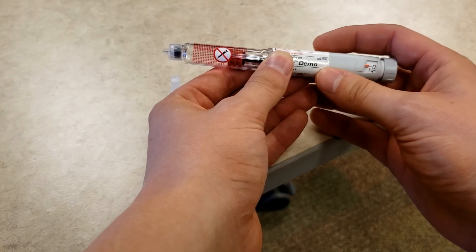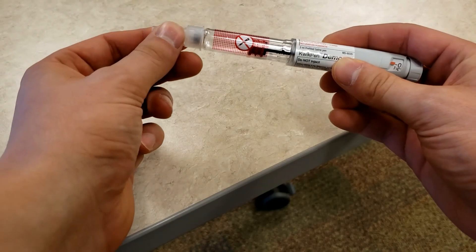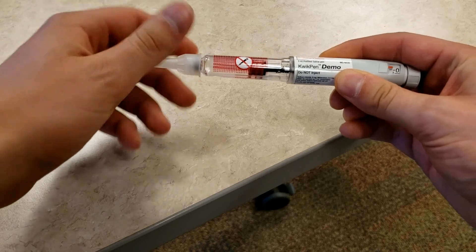To remove the needle from the insulin pen, put the large cover back on the needle. Then, twist the needle to remove it from the insulin pen after every injection.